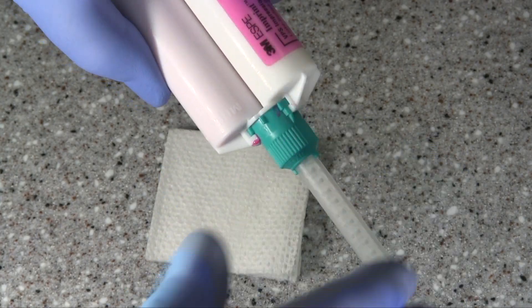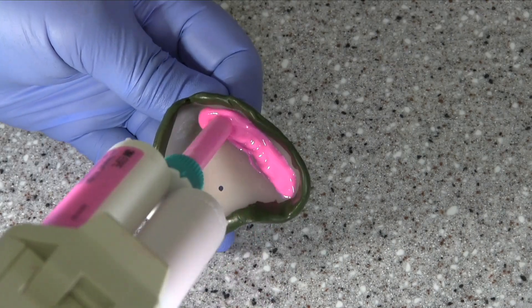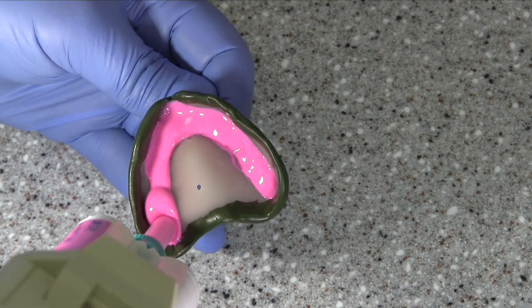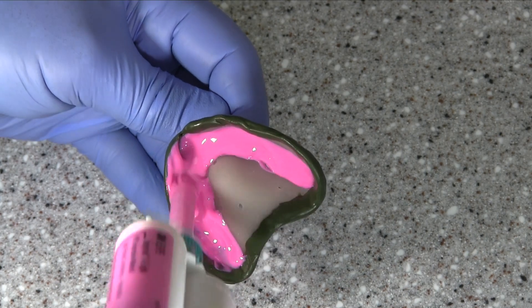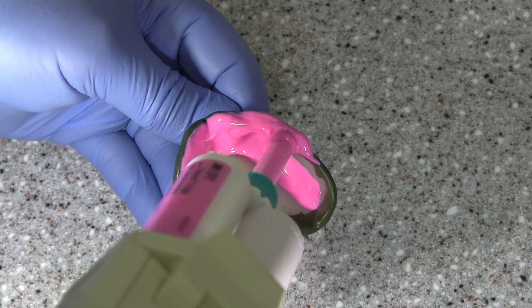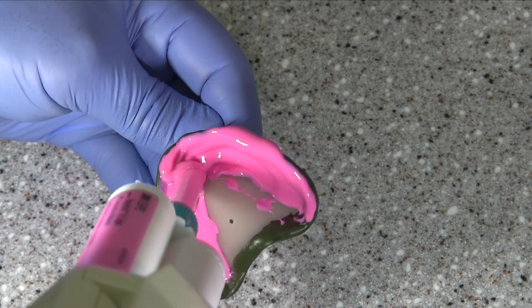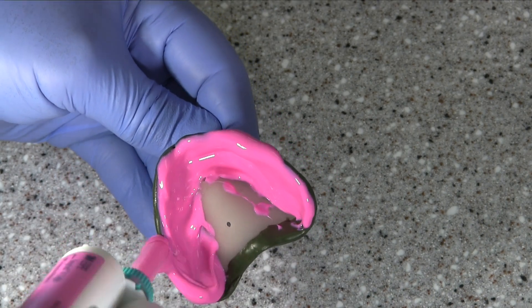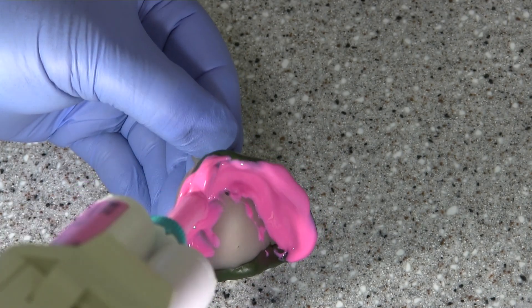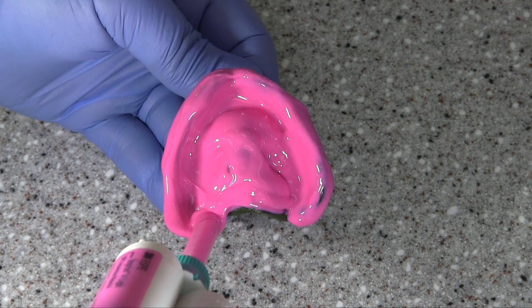Remove the cap from the impression cartridge and express a small portion of material. Attach the mixing tip and express a small amount prior to loading the tray. Load the tray quickly using a slight vibration to cause the material to flow smoothly. Bring the material up and over the peripheral edge of the tray to ensure capture of the vestibular fold. Fill just enough to cover the surface of the tray with impression material. If the tray is filled fully, there will likely be excess material which can cause overextension of the flanges, distortion of movable tissues, and/or gagging.